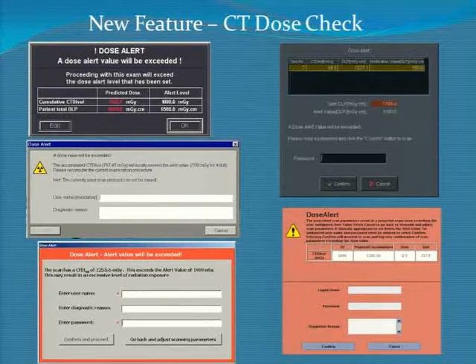And I will warn you, this surprised us on the GE scanners that it was first installed on. We thought we had things set up, but we didn't. On some of the scanners, there are different levels of user that you can set up at the beginning, and you need to get that sorted out really clearly, because we thought we had it under control and we didn't.